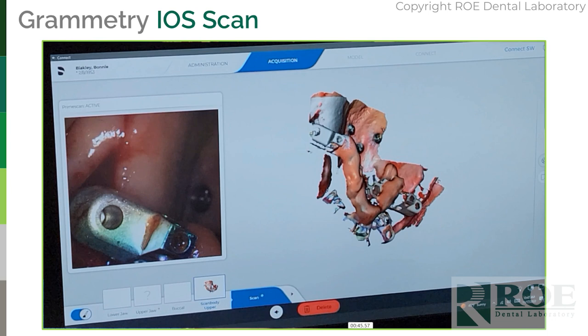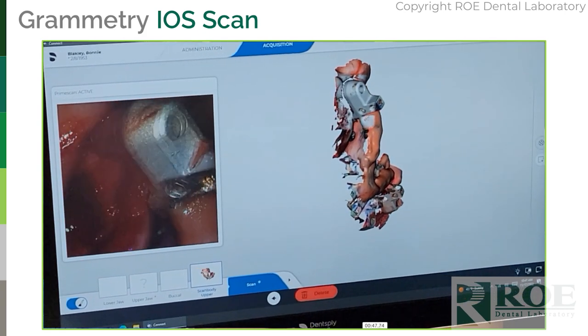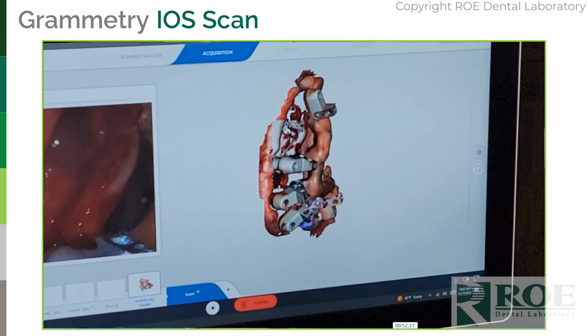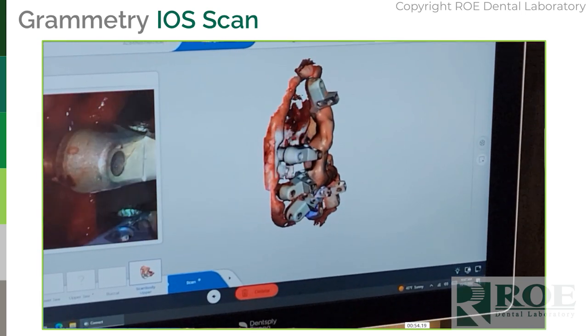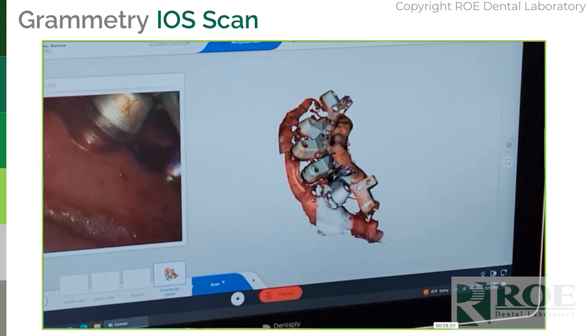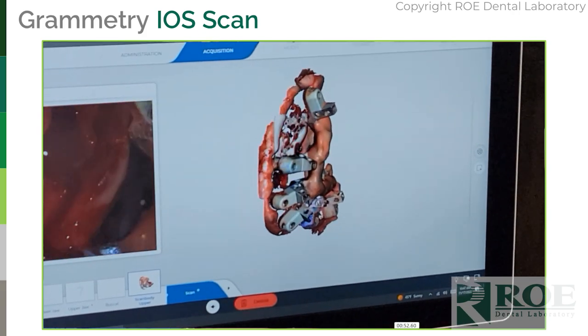Now you'll see in the rest of this video, the protocol was not perfectly followed. You see they went around to the labial and they captured a little bit of tissue, a little bit of bone area there. That's where you can get some inaccuracy with intraoral scans. We don't want any of those scans. We only want the OptiSplint. Okay, so I'm showing you a little bit here of what not to do.